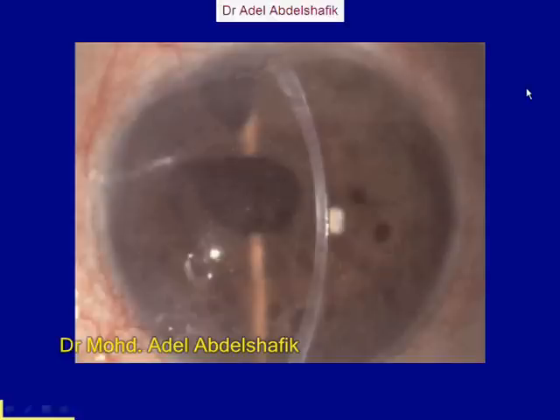What do you say? I would say here the pupil is oval. You get some iridectomy here, and the media is hazy. That's all. Okay, hazy media can be due to edema in the cornea or opacity.